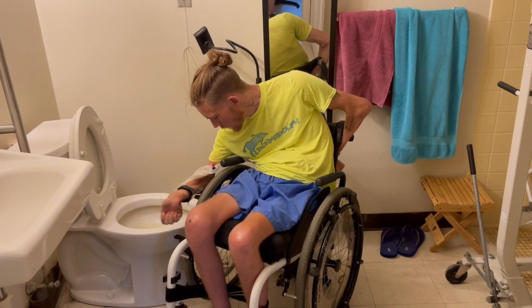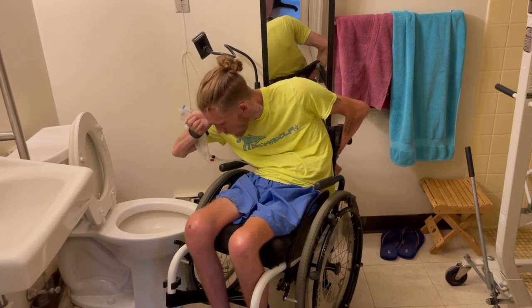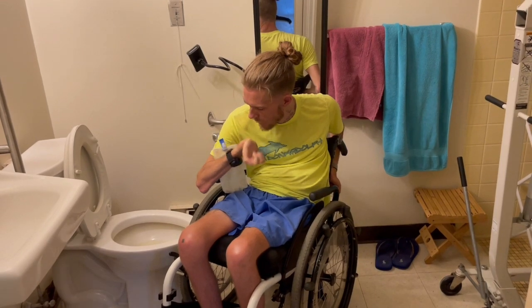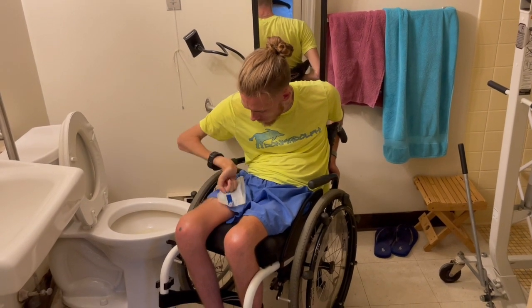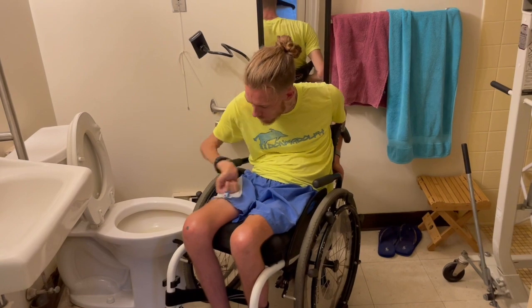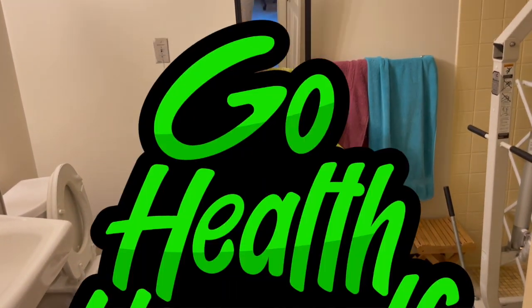I think it holds about 350 milliliters, maybe more — I don't remember exactly. And then to get the excess that's in the nozzle, I just do that with the crook of my arm and then flatten it back out. Close the lever with my hand and then put it right on my side. So that's how I do it if you're wondering.